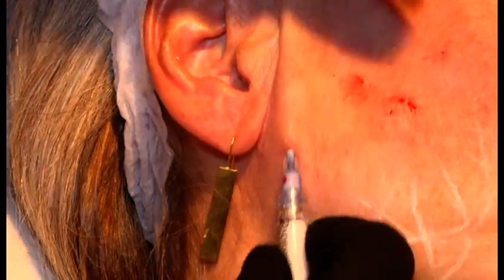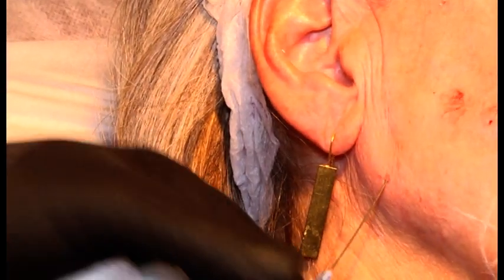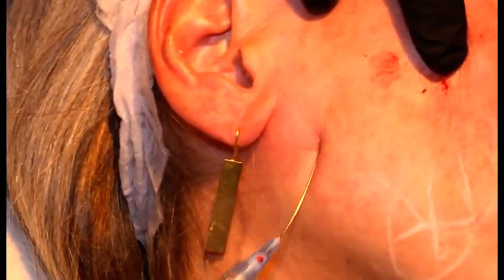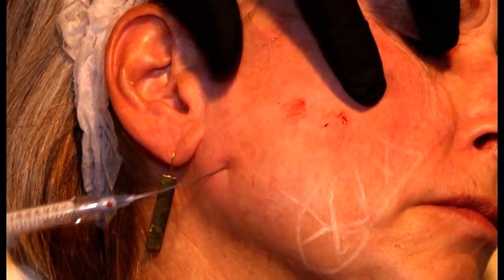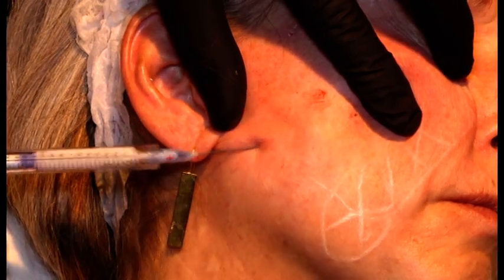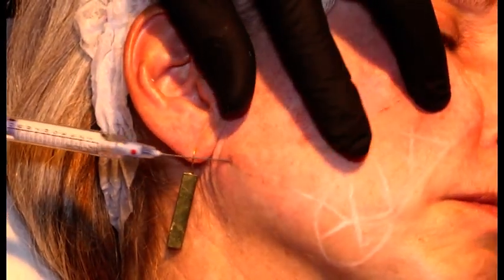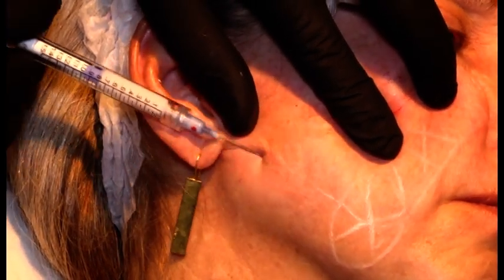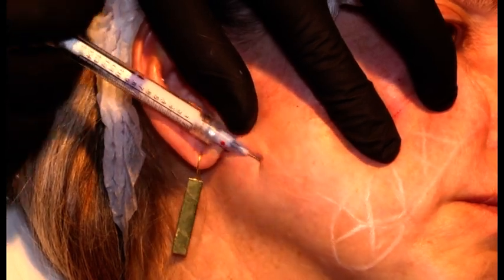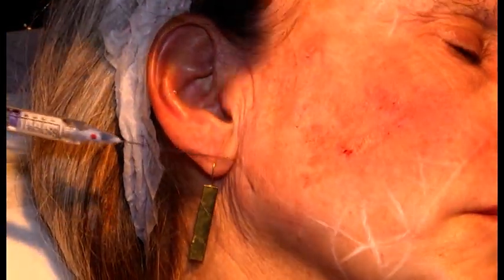There we go. Superficial, I go to the preauricular area. And here I can really inject a nice amount, especially at the mandibular angle and the mandibular borders. And again, I make sure I'm not injecting inside the jowl, just lateral to the jowl. Okay.